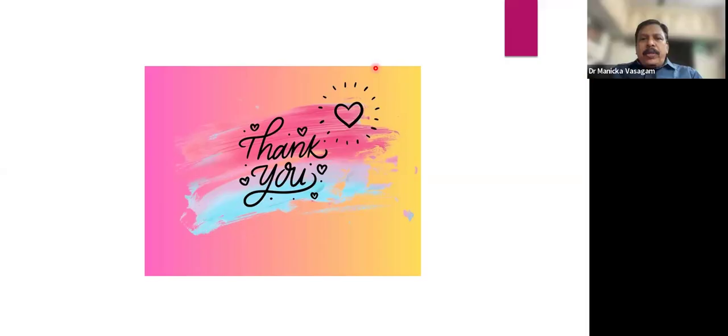Okay. Do you recommend single cone obturation? Yes, definitely I recommend that. With the current concept of bioceramic sealers, it clearly says that you can go for single cone obturation. There is no change in that. Even with the normal sealers you can do single cone obturation. But it depends upon the orifice size and orifice morphology. Suppose you have a cylindrical narrow canal, definitely a single cone GP is more than enough.